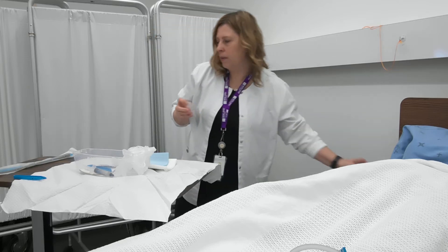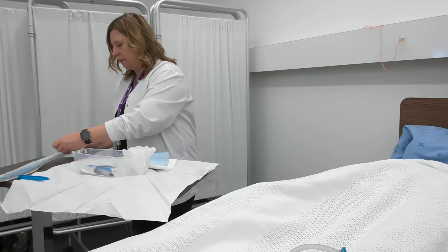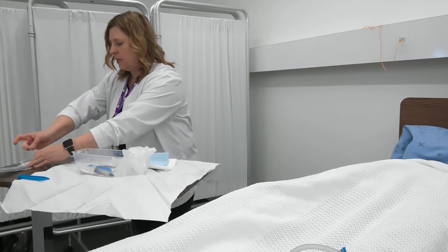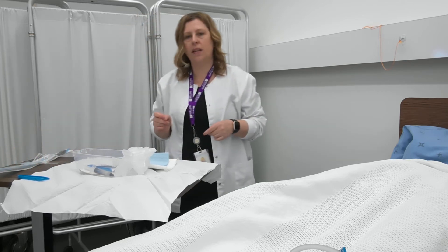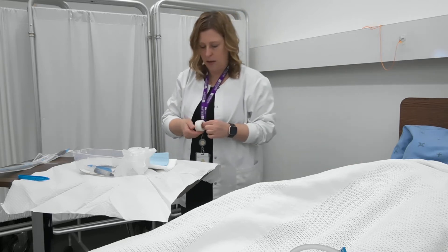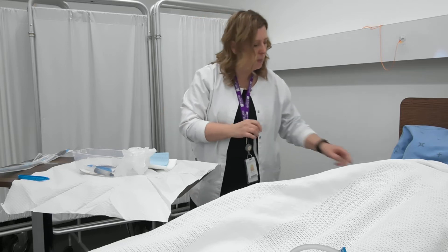I'm going to take my tape, open my package, and tape the catheter package down to my overbed table. That way, once I get my sterile gloves on, all I need to do is just remove it out of the packaging. I'm going to put another piece of tape on just so it doesn't come apart.